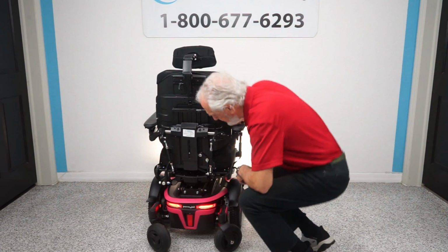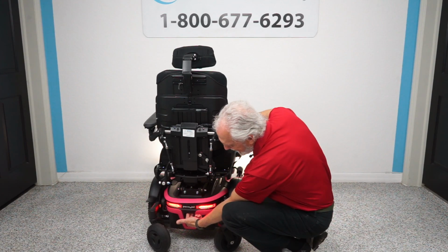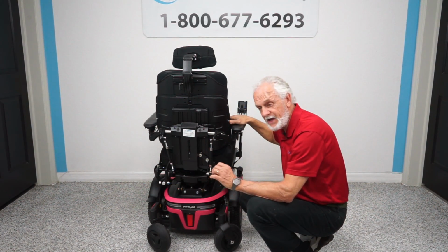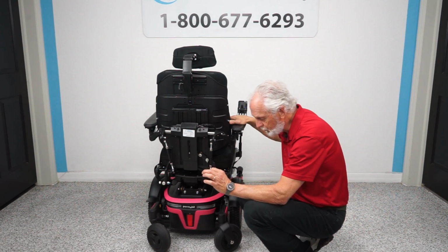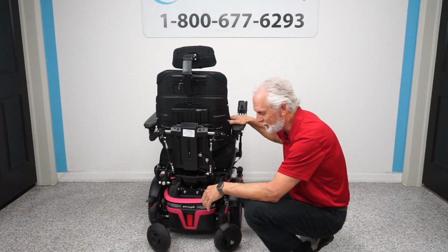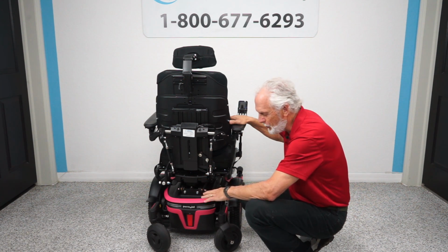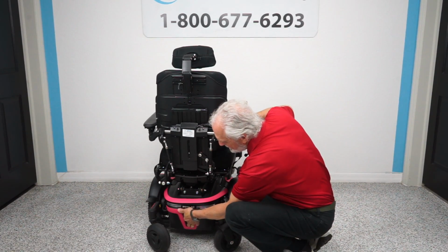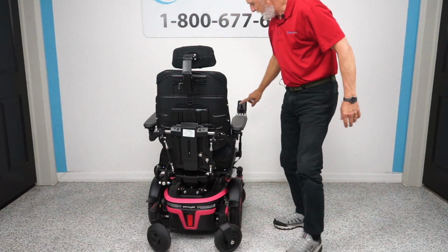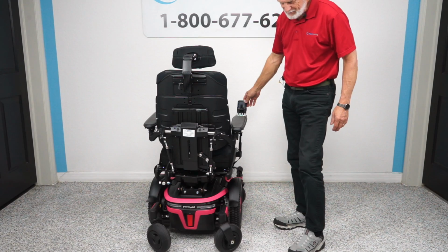One more thing about this chair. Right here, where my fingers are at, there's a reflector. But inside, under the Permobil, there's a breaker. It's real easy to shut off, but when you go to turn it back on, it takes a real strong finger. So if your fingers are weak, it's not because it's not working, it just takes a strong finger. So I'm going to push it back on. There we go. And it is hard. But then you go back here, turn your power back on, and we have our lights back on again.